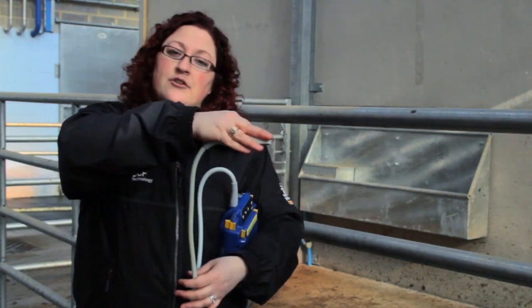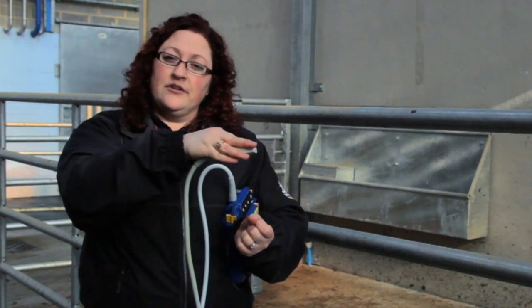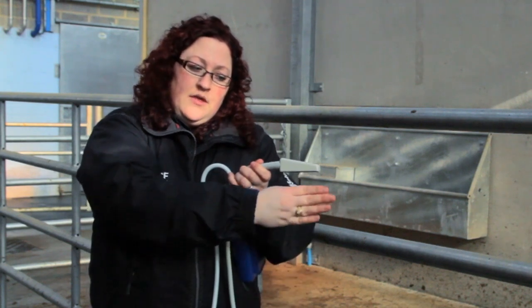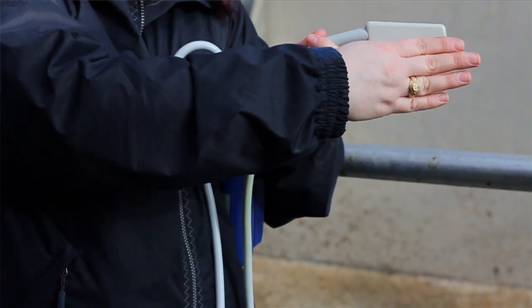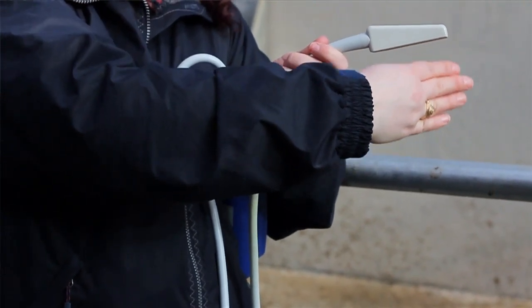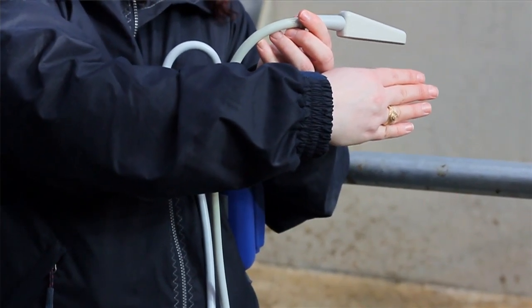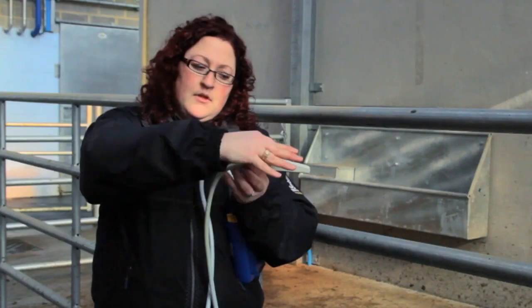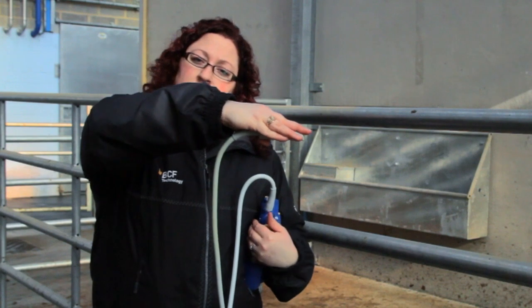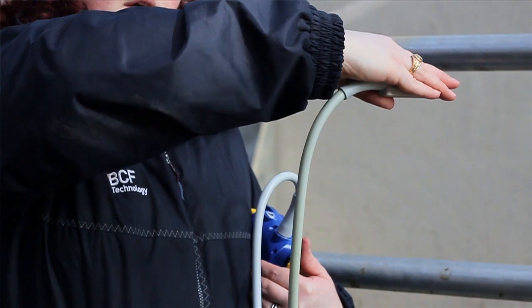The next is actually rotating the probe head to be in line with whatever structure we're wanting to look at. The ultrasound wave comes out of the probe in this direction. So if we're looking at a structure that is in this orientation, we'll just need to change the orientation of the probe so that it matches the structure we're looking at. So what that would look like inside the cow is gently moving from side to side.